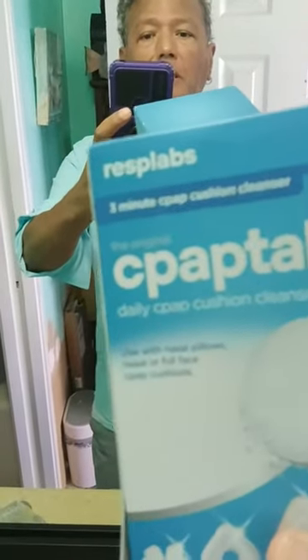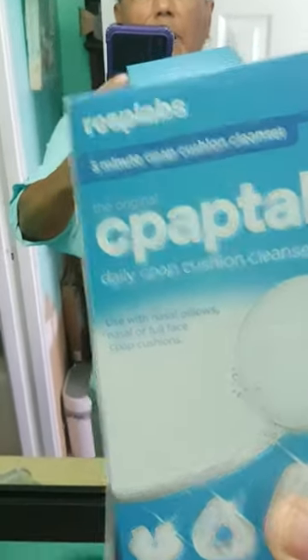Aloha everyone! How are you? It's me, Charlie, and I'm doing a review of these CPAP Tabs Daily CPAP Cushion Cleaner.